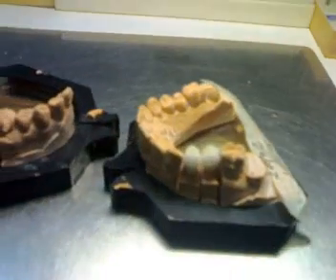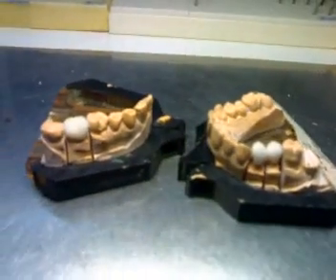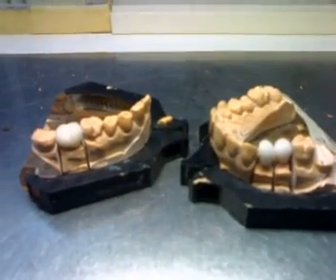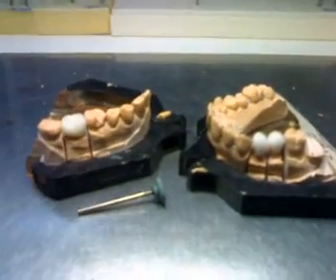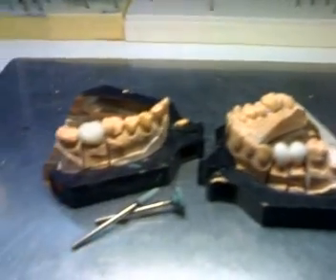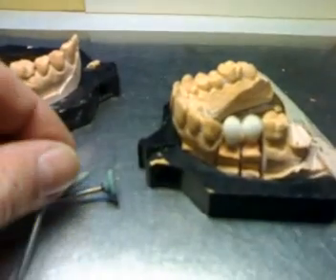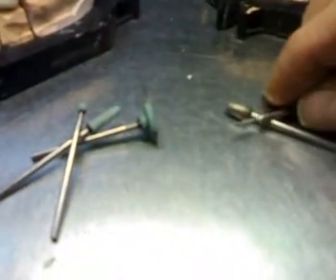One thing I would like to bring to your understanding: these porcelains, before going into the doctor's office, were finished with stone burrs, mostly, of different shapes, as you can see with these I've been putting here. And once they came back in, we worked with diamond burrs.